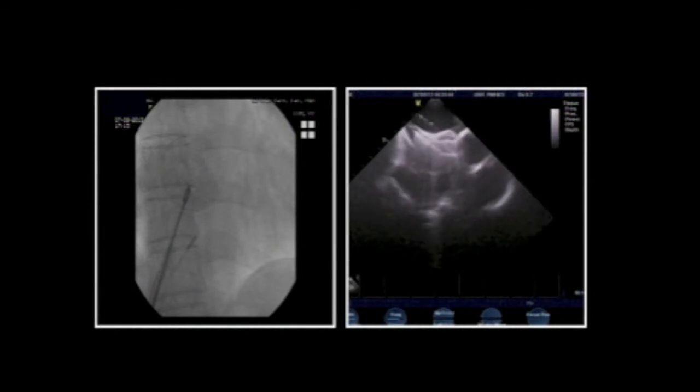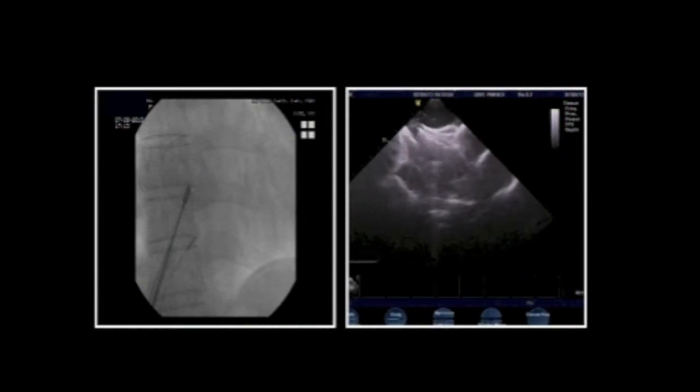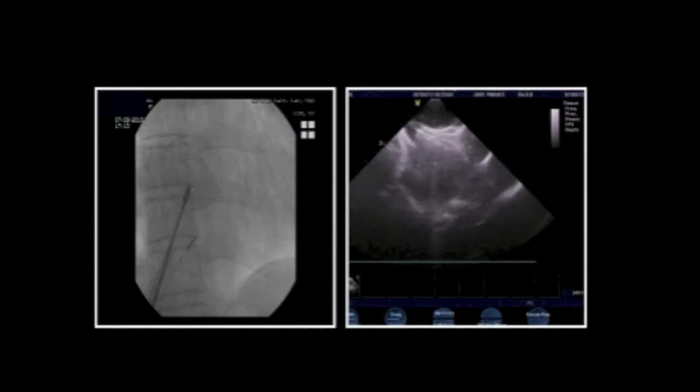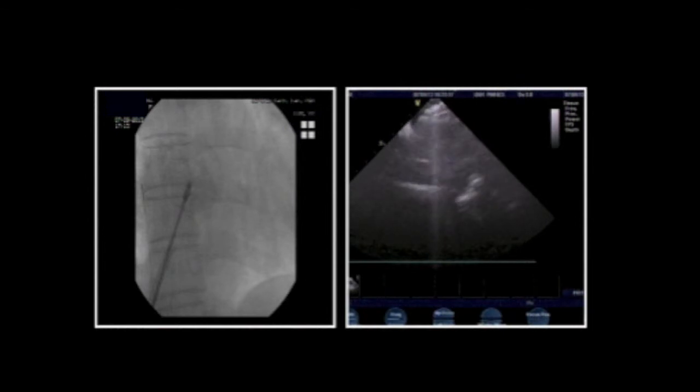Can we see echo large, please. So you can see the posterior rim is in between the two discs, and the two discs are splaying around the aortic root. The device doesn't seem oversized. It's not mushroom shaped. It's a flat device. We can see if we can get a little bit more of a long axis view. Like this. What do you think? I think it looks in a great position. Yeah. And this is, in my opinion, the advantage of the flex catheter, the excellent alignment of the device with the septum. This looks a beautiful result, aside from the AFib, of course.